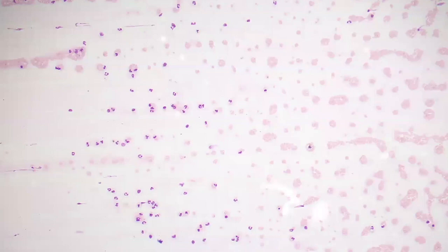So here's an example of a sickling disease. This is a hemoglobinopathy, sickle cell anemia. Hemoglobinopathies are mutations in the hemoglobin genes, as opposed to deletions as seen in thalassemias. This hemoglobinopathy is a production of abnormal hemoglobin.